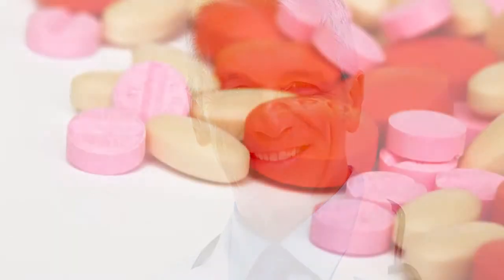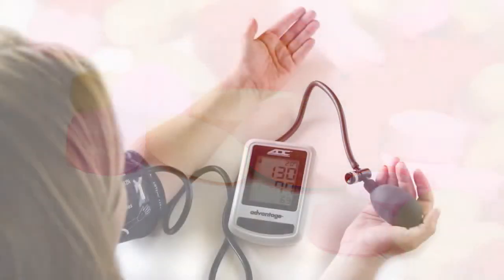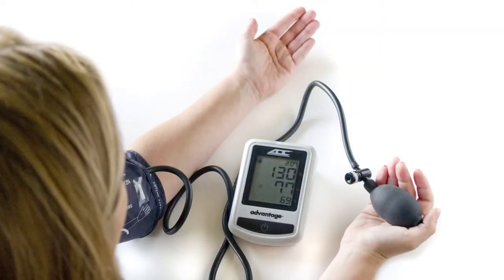Remember that self-monitoring is meant to help your doctor make informed decisions about your health. Never stop medication or alter your dosage without consulting your doctor. Continual home monitoring of your blood pressure, when done properly, can help you and your doctor better understand and control your blood pressure.